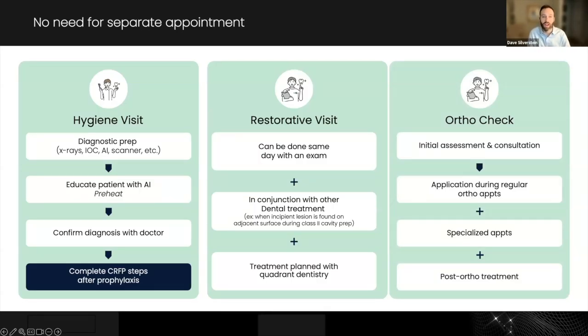So obviously, number one in the hygiene visit. At the restorative visit, if we're going to do some fillings in the upper right, and then let's say number three along the gum line was not a lesion that required any mechanical removal of enamel or tooth structure, just needs a little Curodont placed on there. So what we would do is we'd complete the fillings on the upper right, and then we'll say to my hygienist, "Hey, we're ready for the Curodont before the patient leaves," and she'll come into my room and place it.